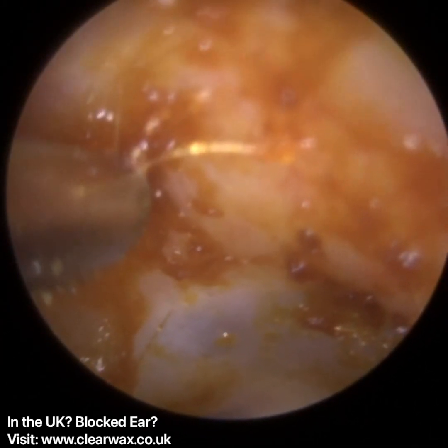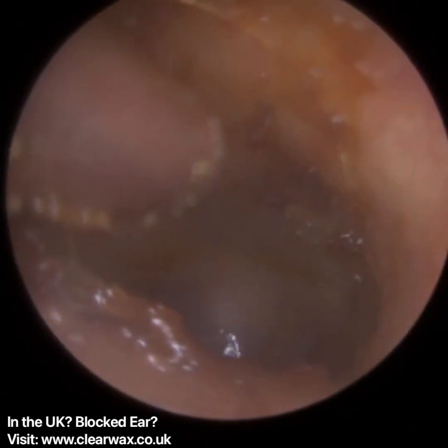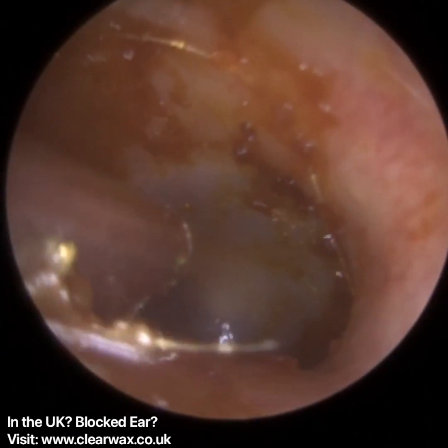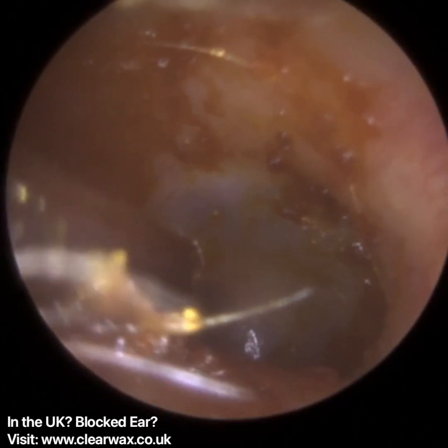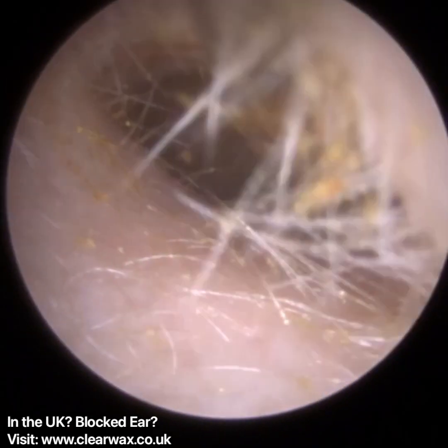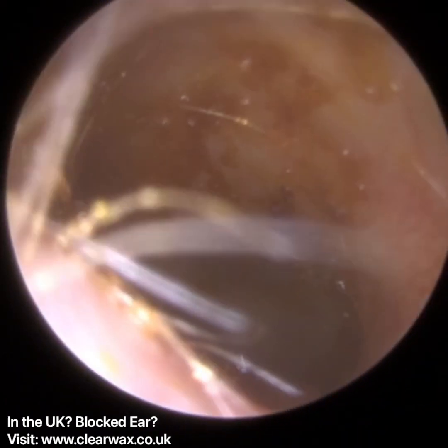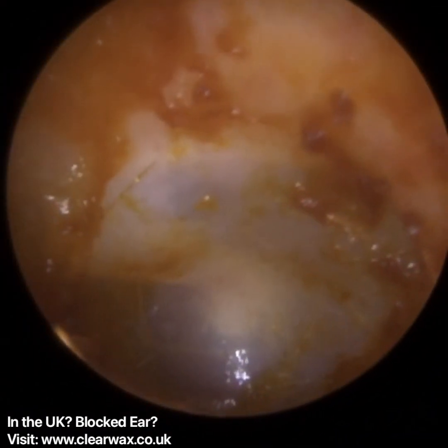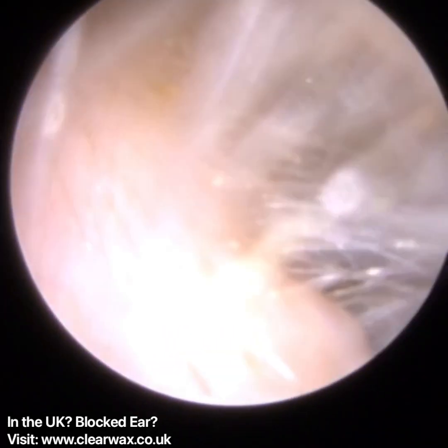But you can see with an endoscopic approach, we kind of made light work of that. I mean, we could have stopped this a while back, if truth be told, but we managed to clear the blockage. And this is more on the cartilaginous portion, so we can put a bit of pressure there. Cartilaginous portion, semi-sensitive, semi-flexible, so it's not going to be as uncomfortable for the patient if we put pressure. There's the eardrum. And now we're on to the right side.